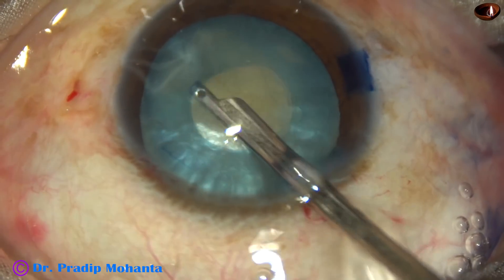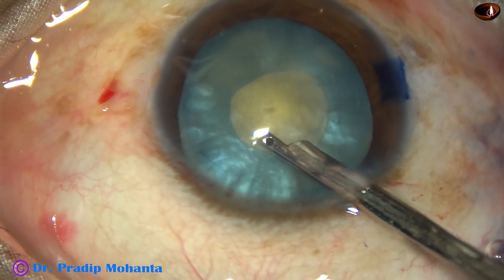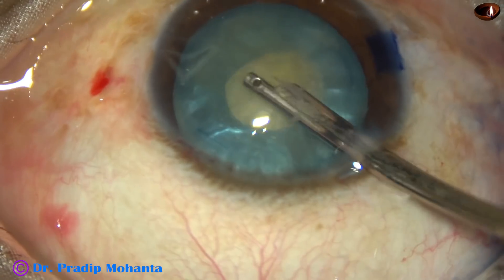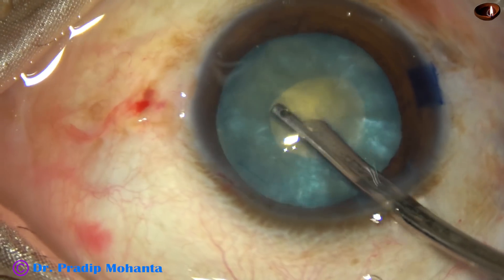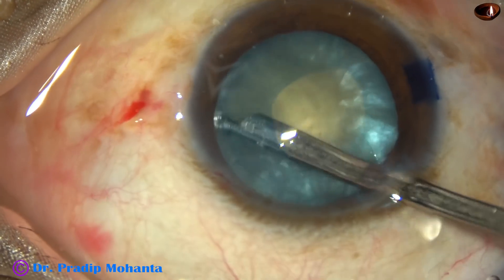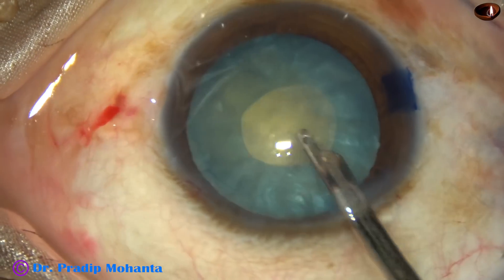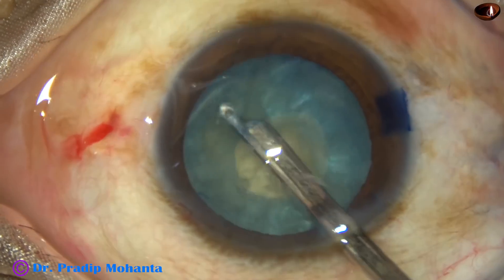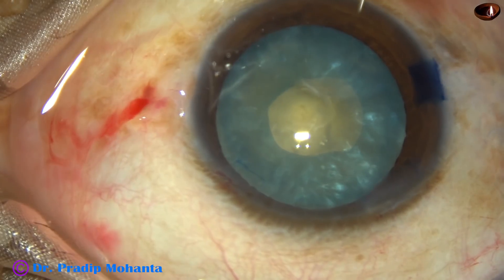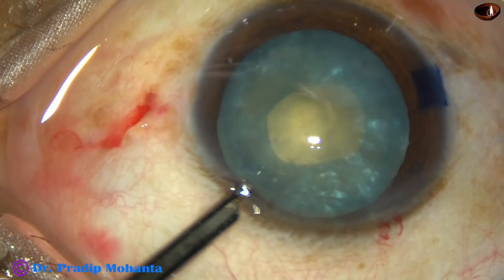If the rexis tends to run to the periphery, we have enough room of safety for pulling the rexis towards the center. But if we aim for a large rexis, it will run under the iris and it will be difficult or impossible to rescue the rexis. The next step is removal of some cortical lens matter to reduce the intralenticular pressure.